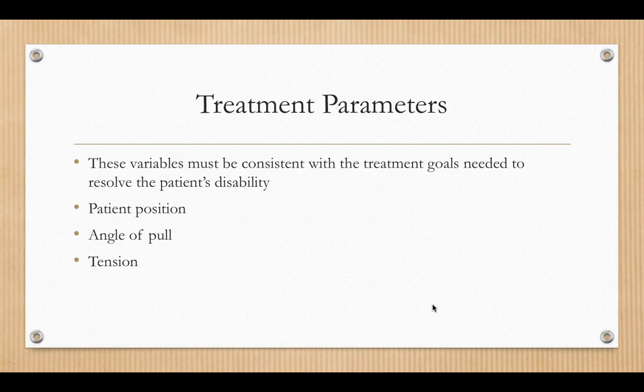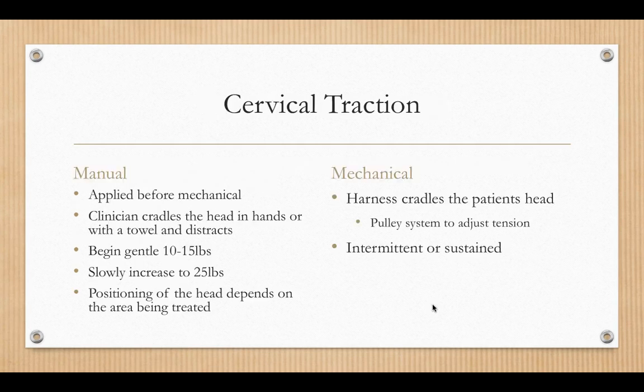If you need to review what those terms are, look back at the first couple videos, as well as that chart in the second video that goes through positioning and so on for angle of pull and the type of sustained or intermittent compression, or traction, that you might need.